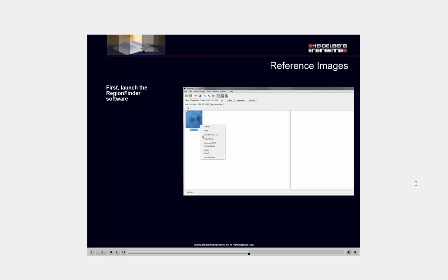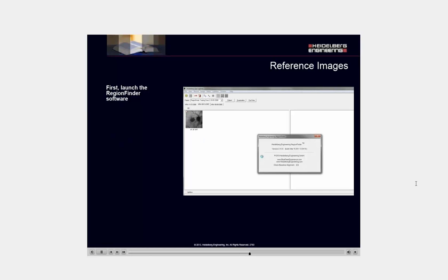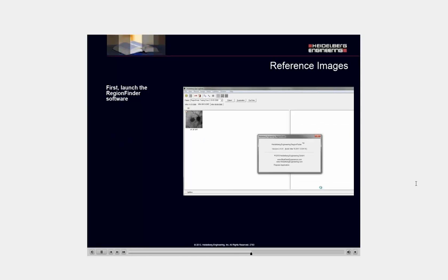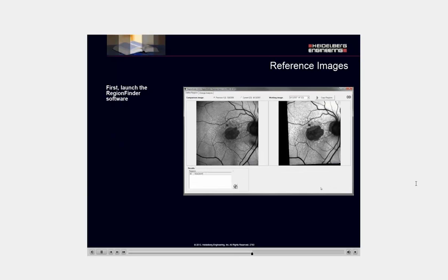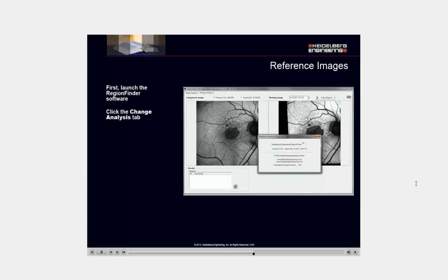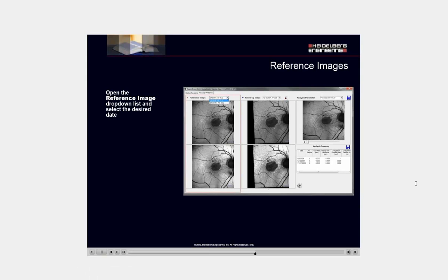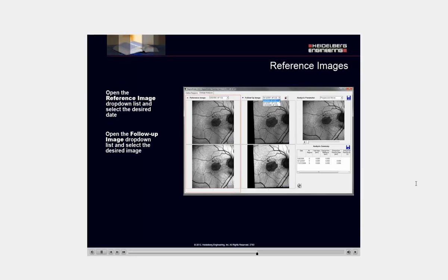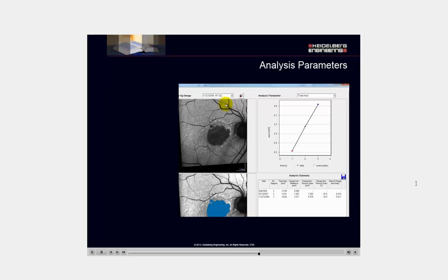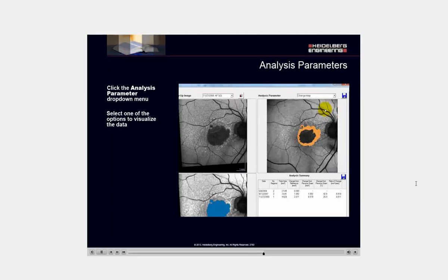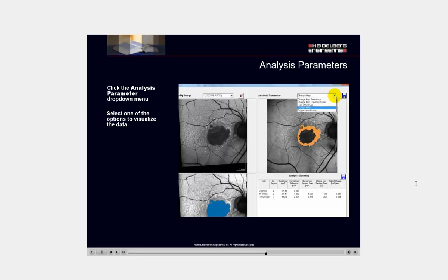First, launch the region finder software. Click the change analysis tab. Open the reference image drop-down list and select the desired date. Open the follow-up image drop-down list and select the desired image. Click the analysis parameter drop-down menu. Select one of the options to visualize the data.